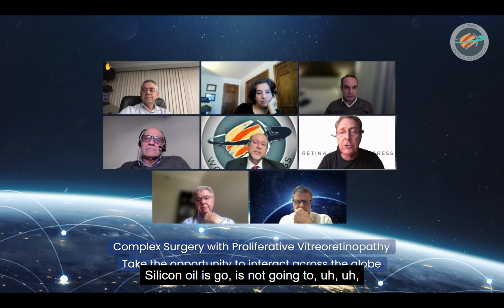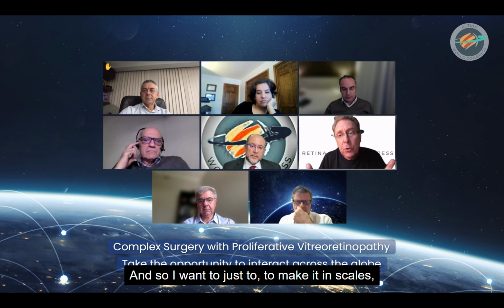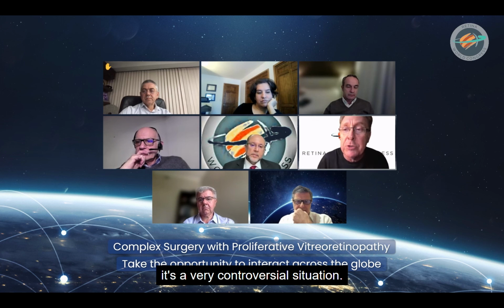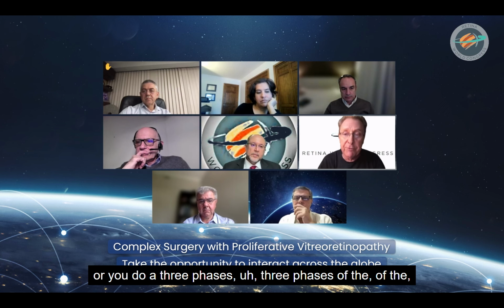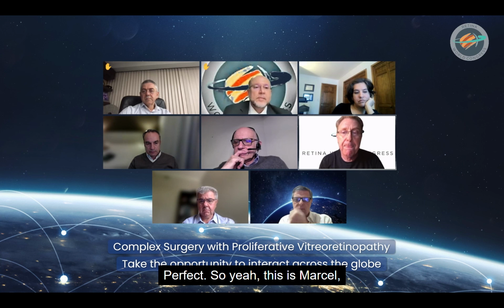Silicone oil is not going to repair my PVR. The silicone oil is a tamponade. But that is a very controversial situation, if you do a direct exchange or you do it in three phases.